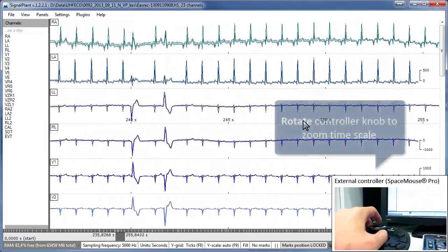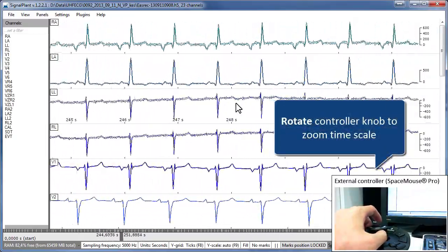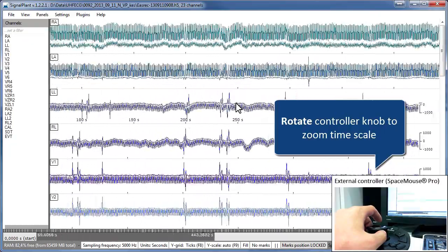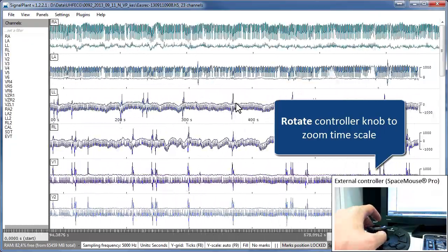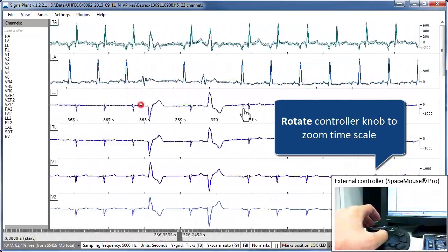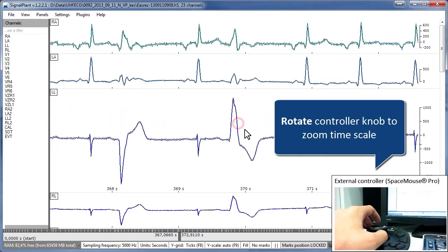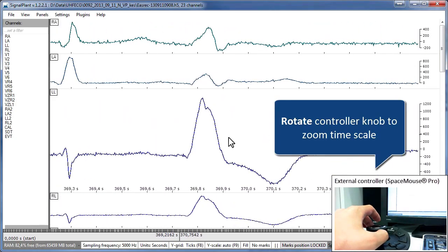You can change the time scale by knob rotation in horizontal plane. The effect is the same as when using mouse wheel but definitely less tedious and faster.